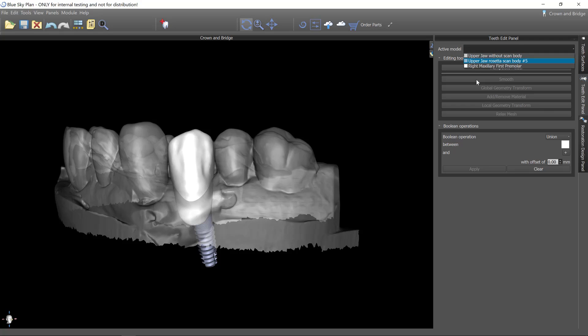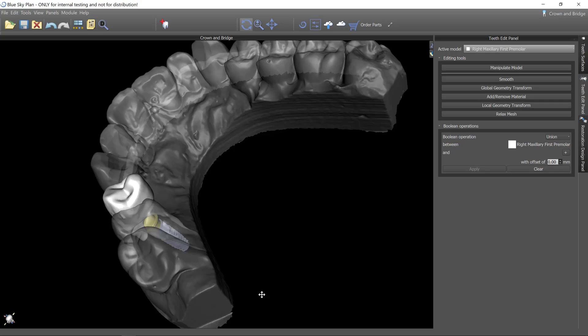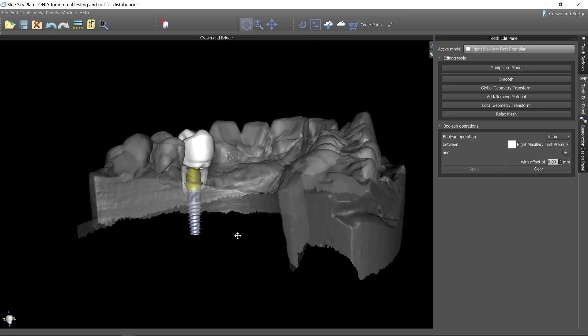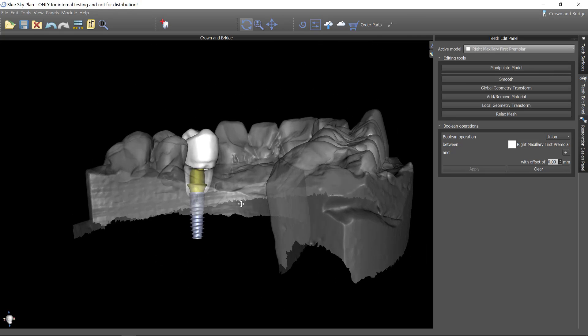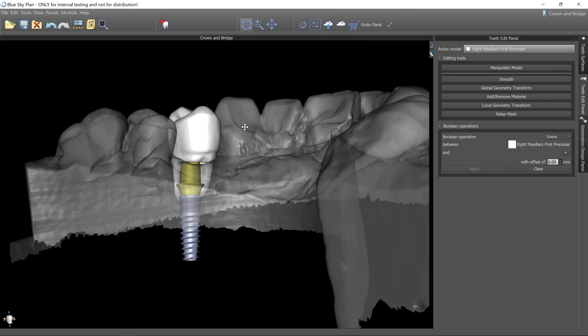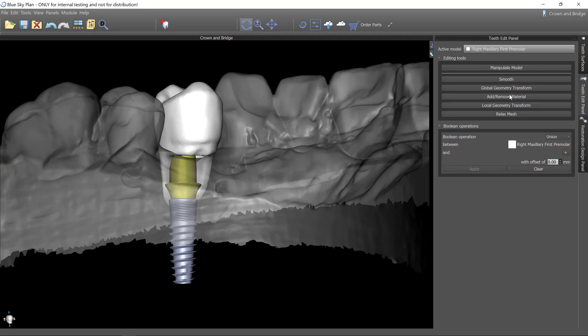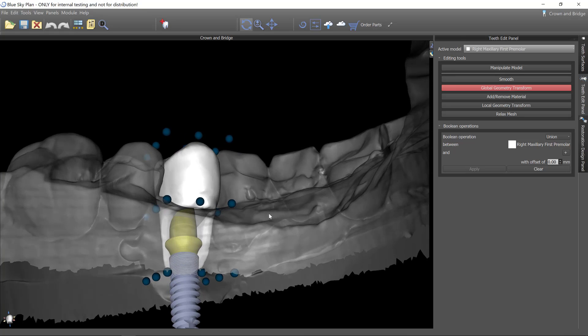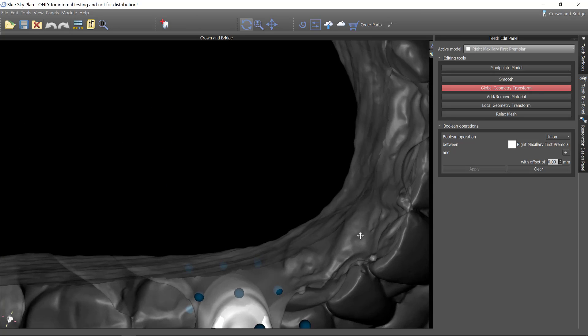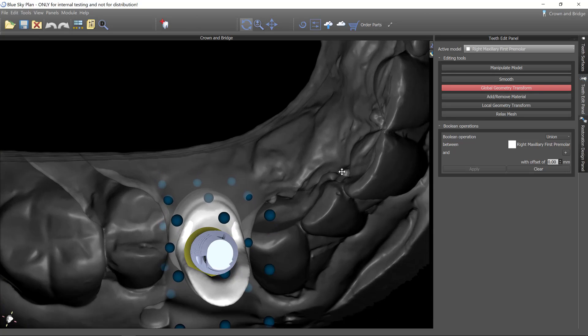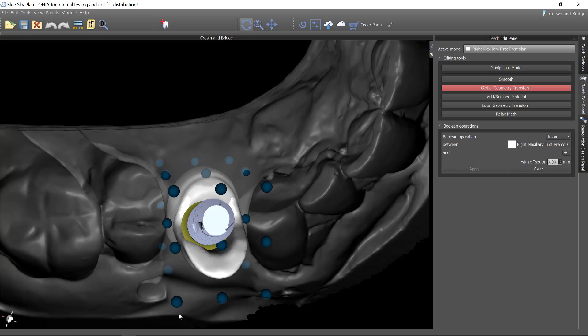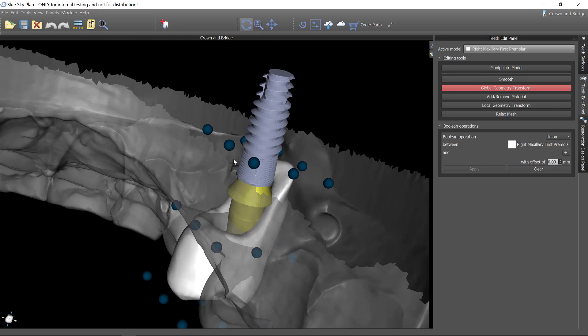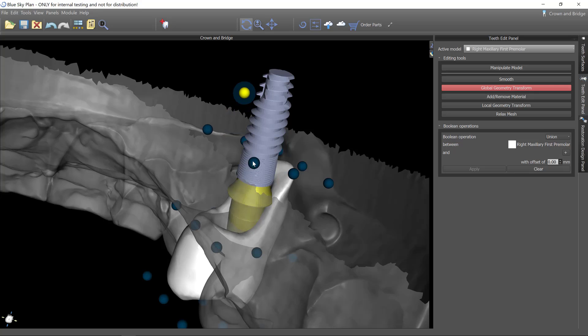At this point we could select the right maxillary first premolar and we could begin manipulating this. So one thing you want to do with this software is you want to roughly get this tooth in its final shape before you move on to creating the abutment. We're going to have all of the global deform tools so I can use this object which puts a boundary box around this and enables me to scale different parts of it. So I could grab this, stretch the tooth up this way, same here.